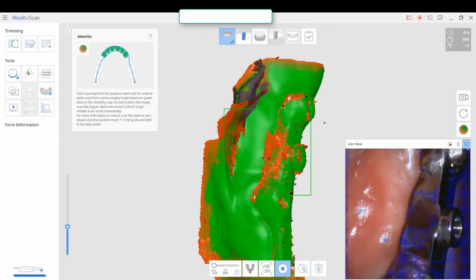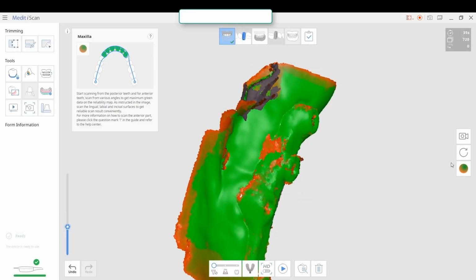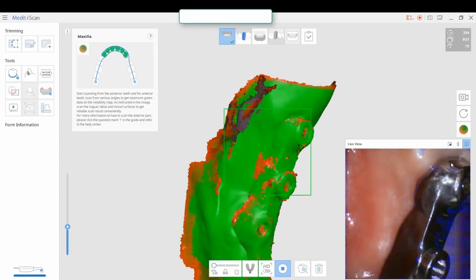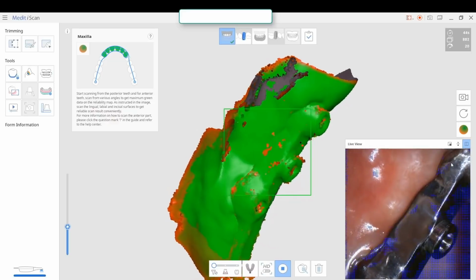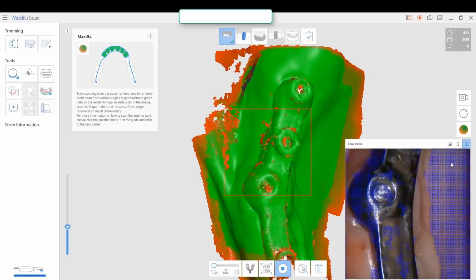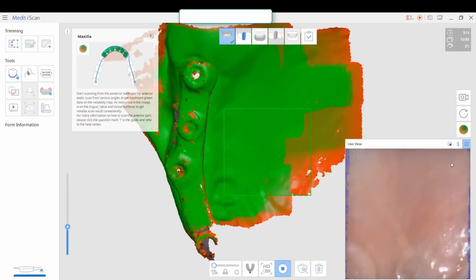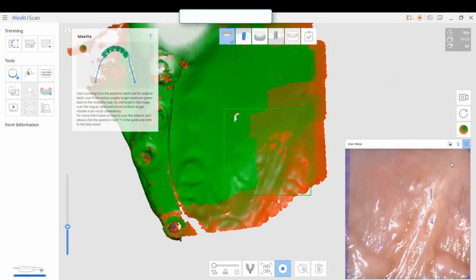And then if you look in the lower right quadrant, we have a live window, and anything that's purple in that live window, and there's a silhouette of it, is an area the camera or the software cannot see. So just by angling the camera and hitting it from a different direction, you channel the light to reflect off of that in a different direction so the cameras can pick up the images that are bouncing back off that object.